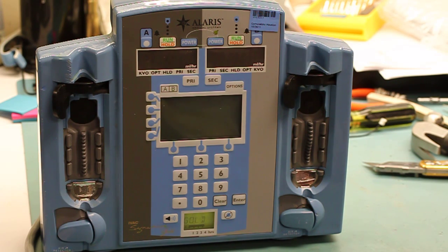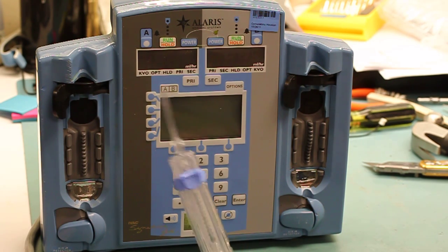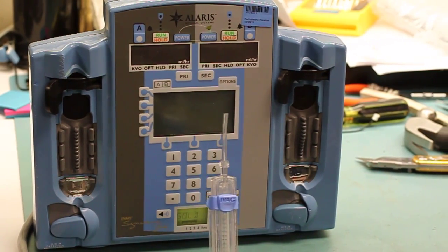This video is being made to help you see how we need to properly insert an IV cassette into an Alaris SC pump without breaking the air-in-line transmitters. This cassette is symbolic of a regular IV tubing set and is being used for demonstration purposes only.